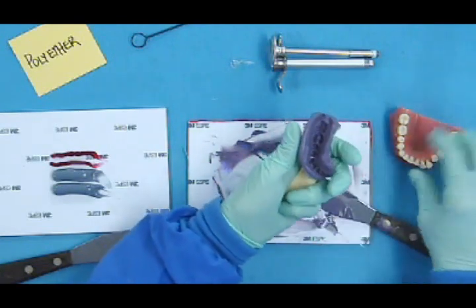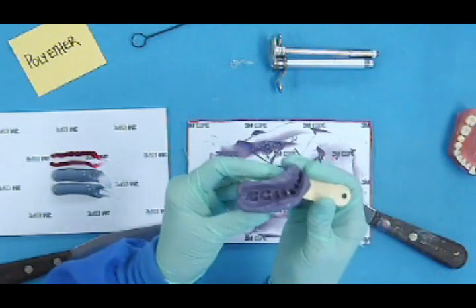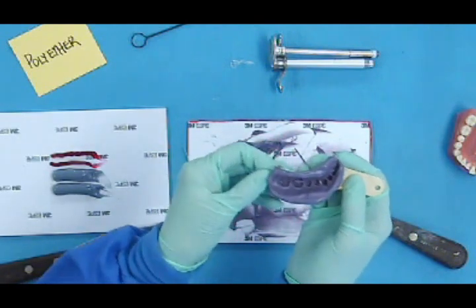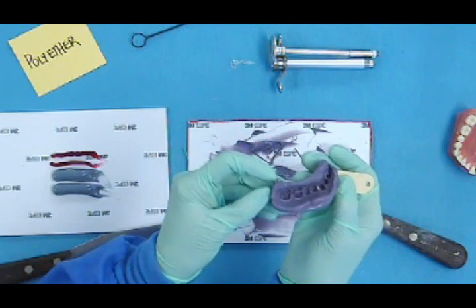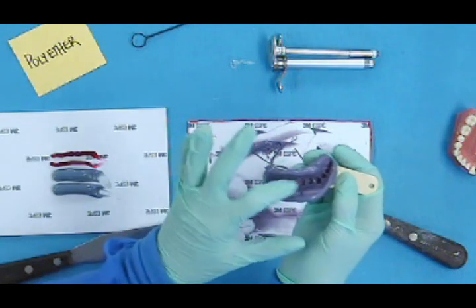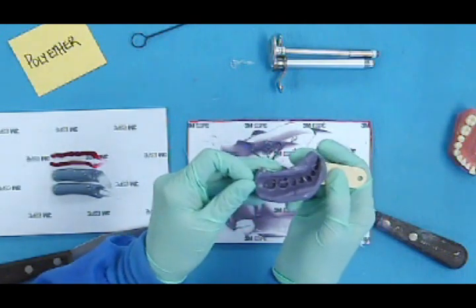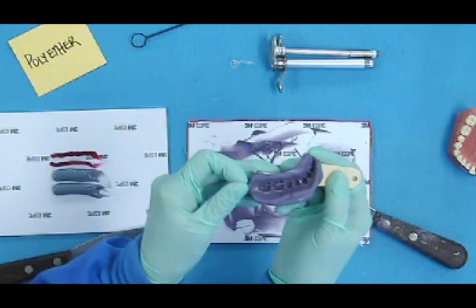All right. So the doctor would look very closely and very carefully to make sure that there were no bubbles or voids in the area of the prep or the impression. If there was, you would have to take another impression.